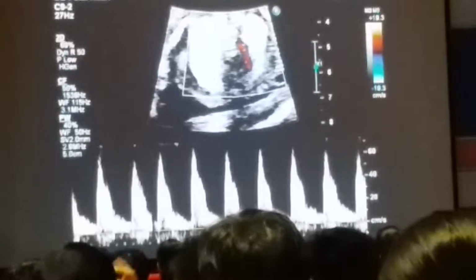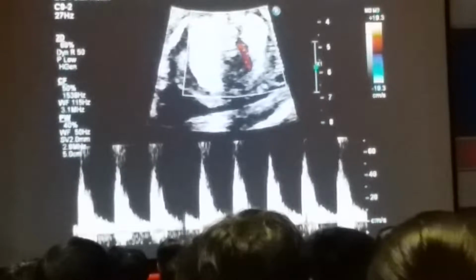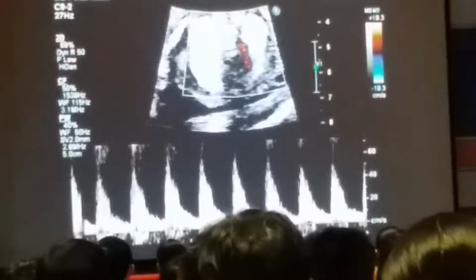You know any other sphincters in the body besides the duct? The esophageal. You thought I was going to say something else, didn't you? Okay, all right. So now we've done that. Let's get off scale and let's get off Doppler.